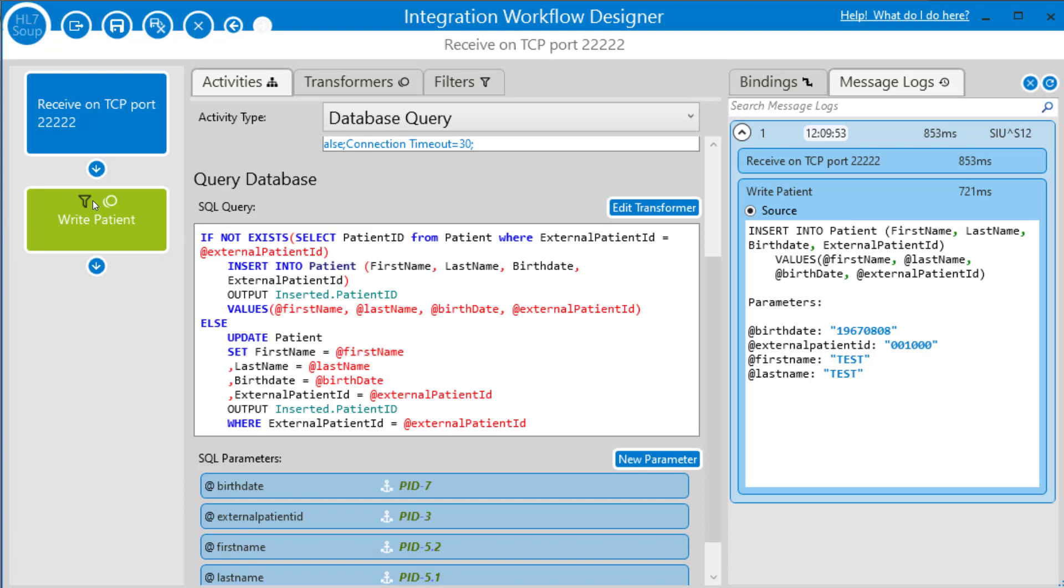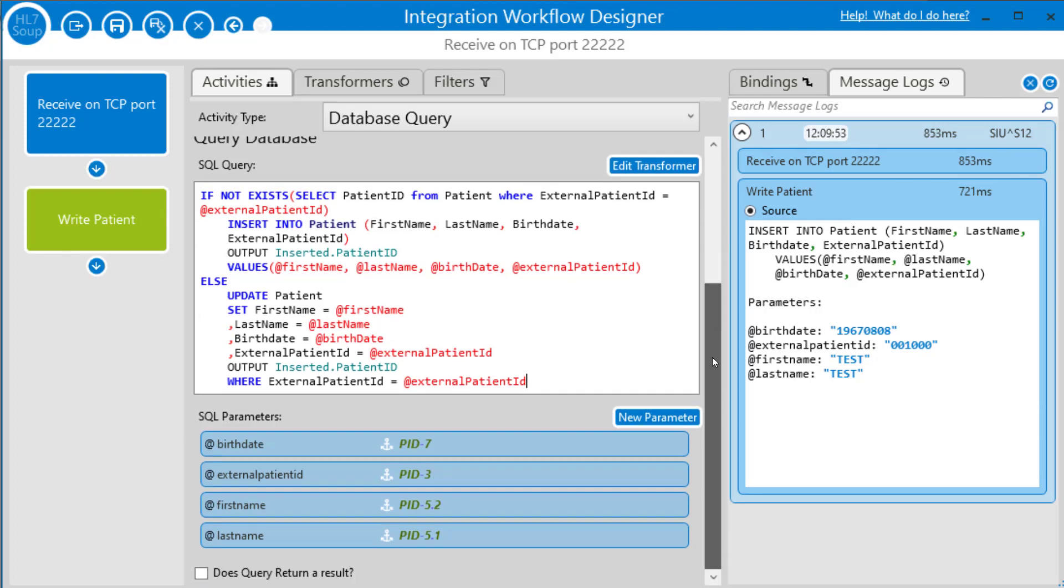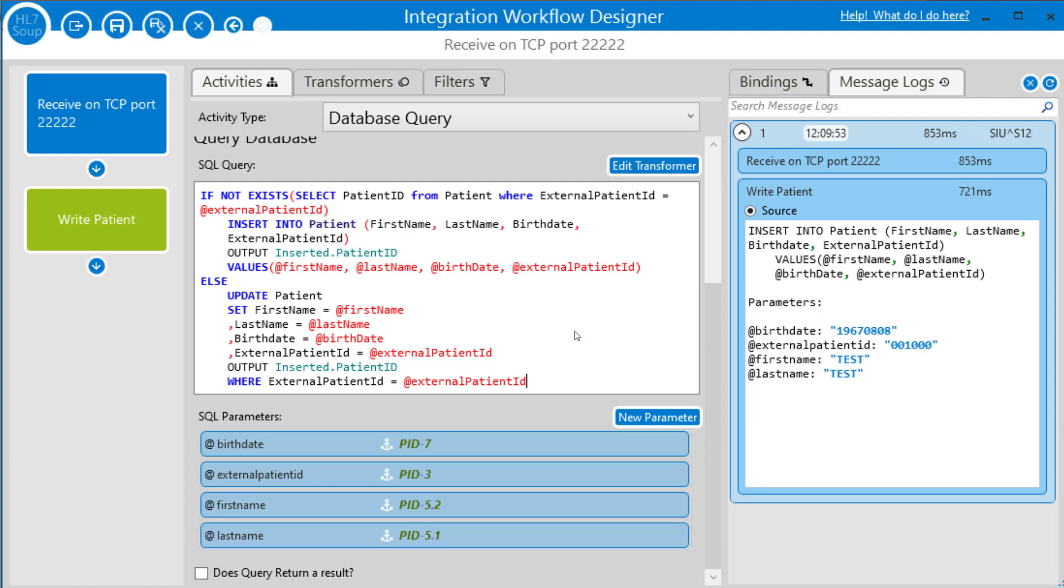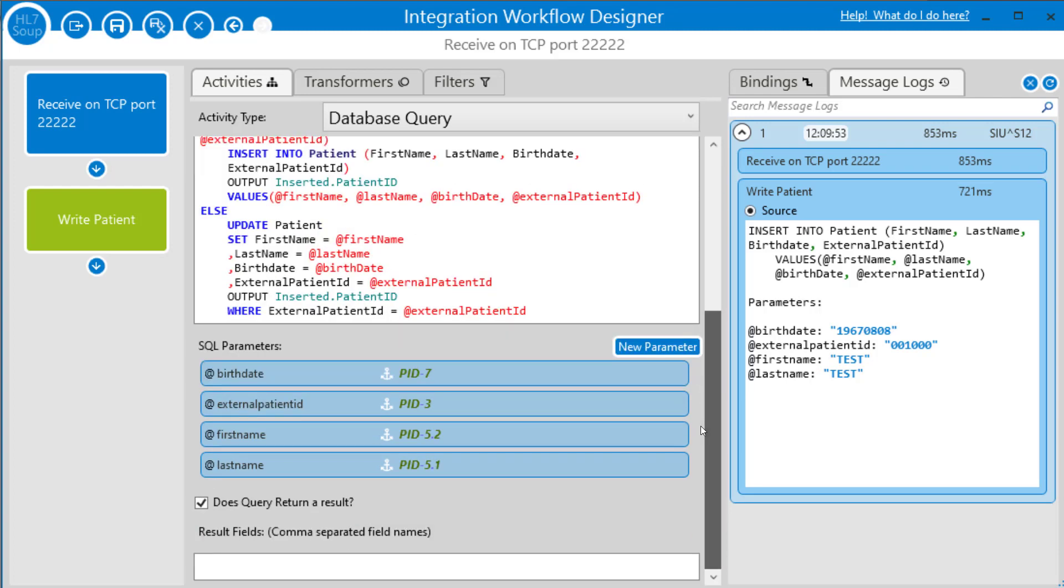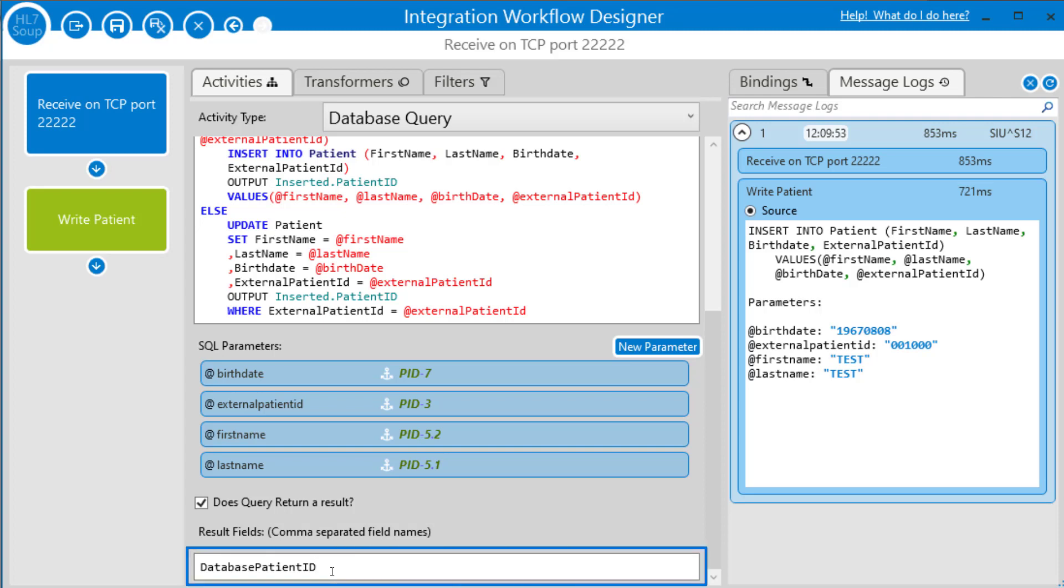So I want to be able to get back that patient ID that was generated in the database. So I'm going to upgrade this query now, paste in a bit more functionality. I want to be able to handle if the patient already existed in the database. So I've got an if for that, that checks if it already existed or not. And if it does already exist, it will update it rather than insert it. We see that it's used the same parameters. And so the parameters that come across anyway, even though I pasted and also we put an output after the insert or the update. So it outputs the identity field patient ID from the database and we'll use that writing to the appointment. So let's tell the activity we are getting a result back and we will just call that database patient ID. We're just returning a single value. If you're returning a record set with multiple columns, just list all the columns here comma separated and they'll become accessible into your workflow.